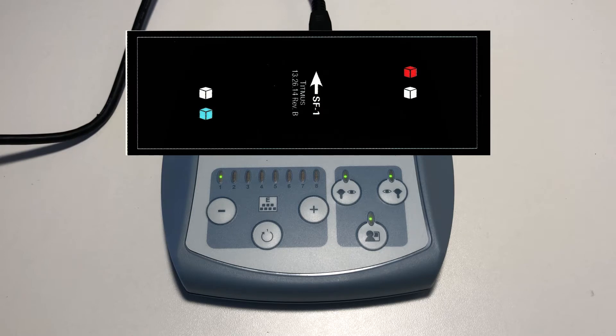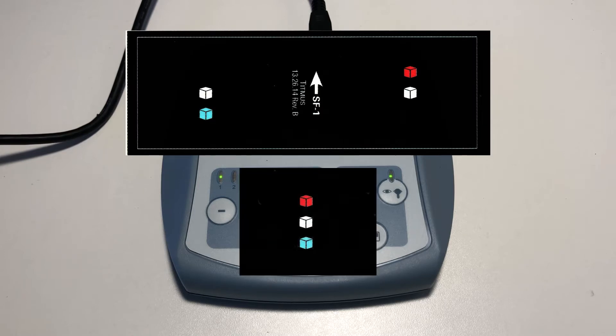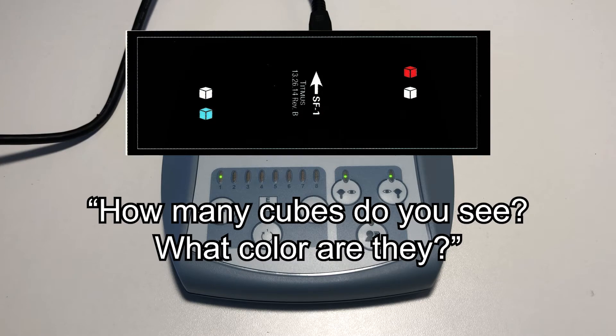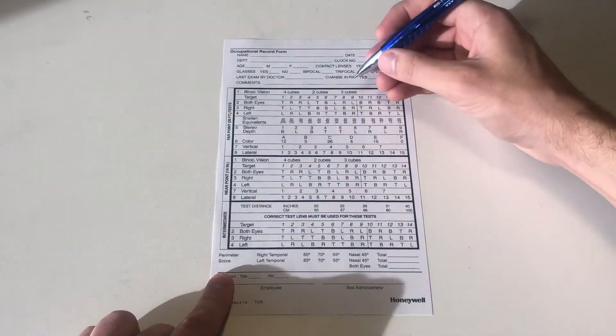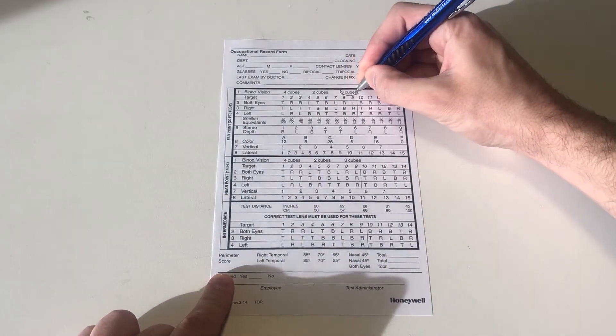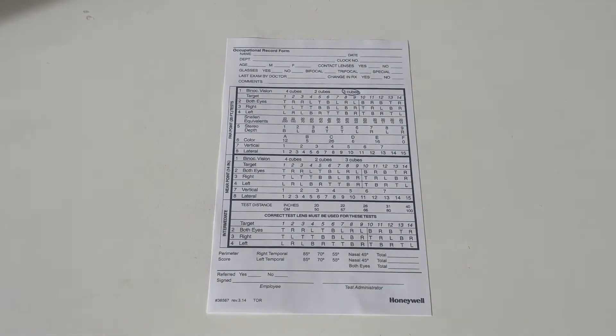This slide is testing the patient's binocular vision abilities. When their eyes adjust, the patient should see a combined image that looks like this. Ask the patient, how many cubes do you see and what color are they? On the record form, mark the number of cubes seen by the patient in the first section of the Farpoint test box.